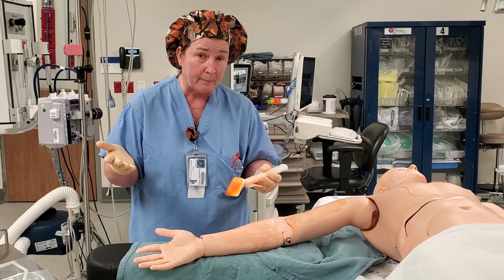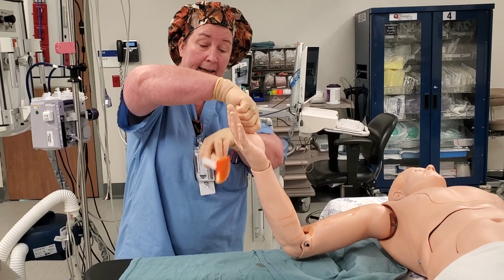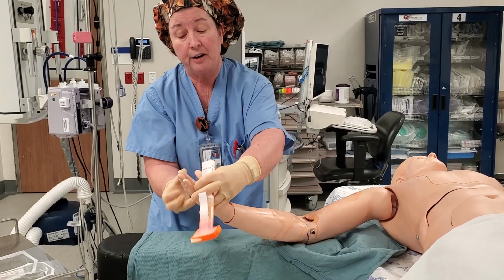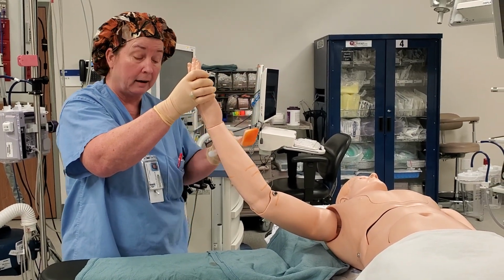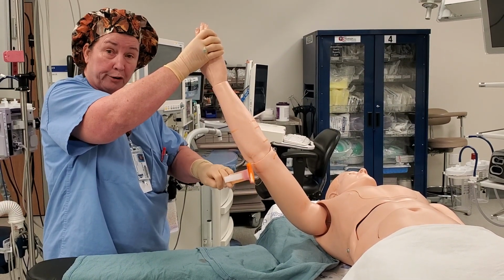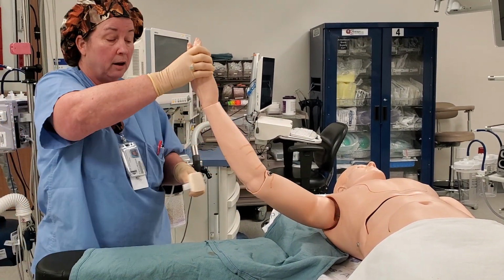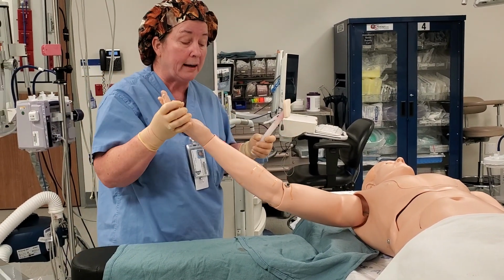At that point, I could take my sterile hand, other hand, lift up the arm and get the back of the hand, throw this Chloraprep away and get a new one, and now I could raise the hand that I've already prepped, take my new prep stick, start from underneath and do my 30 seconds on my ulnar nerve site, go up to the arm, catch the axillary area, throw this one away, grab a new one, and come down the forearm. So there's multiple ways to do it.